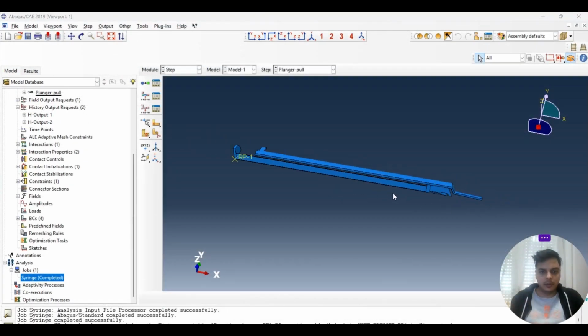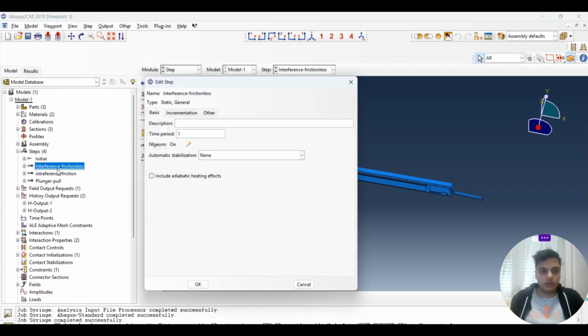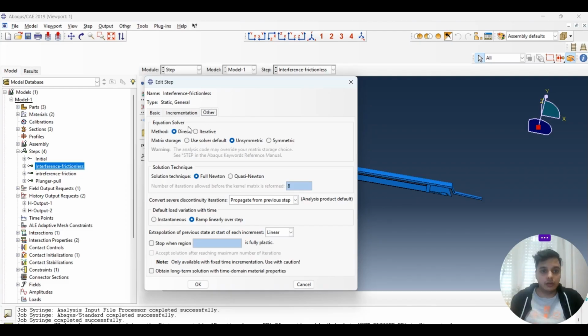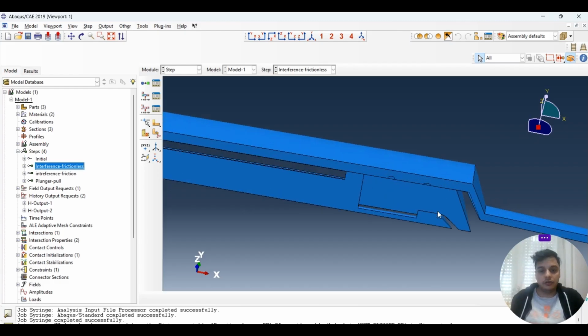Alright guys, this is a completed version of that particular example that we did. So what exactly I did, there were some errors, so I fixed some of them. Make sure whenever you are trying to run the analysis, you also account for those particular errors. The first and foremost thing was there was a lot of unsymmetricity. So what I did, I went to this interference frictionless part where we have defined our initial step. Just go to the other, just change the direct solver from the symmetric storage to the unsymmetric one, so that the software can deal with those unsymmetricities and the frictionless issues, since we have some initial interference.